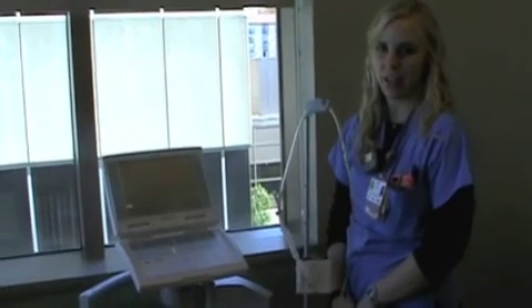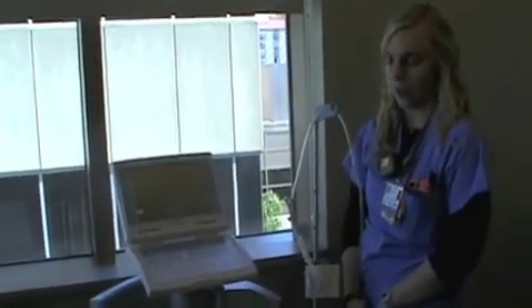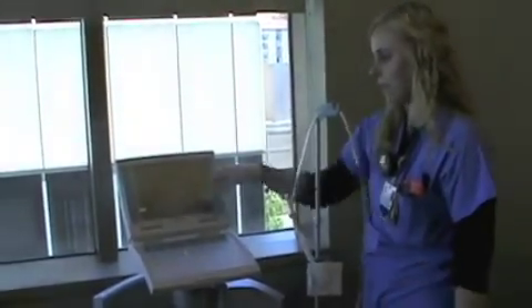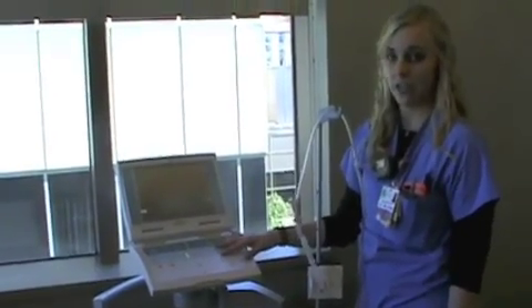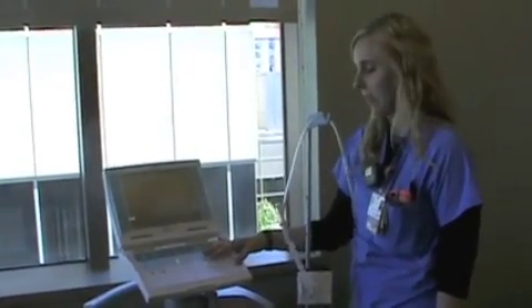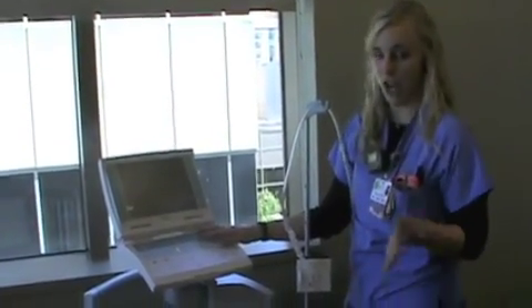Hi, my name is Allie. I'm a nurse at the CICU on the Plaza. We're going to talk about having a rapid gas loss alarm on your balloon pump. If you see that come across the screen and it's beeping, the first thing you want to do is check your patient. Look at your patient and see if their hemodynamics are stable or if they've changed at all.